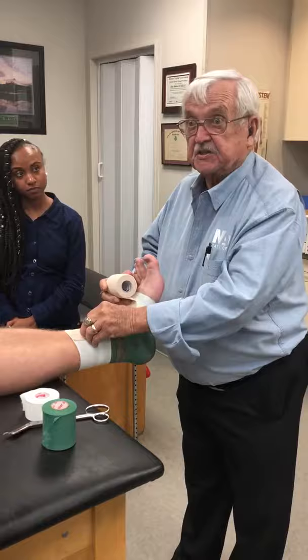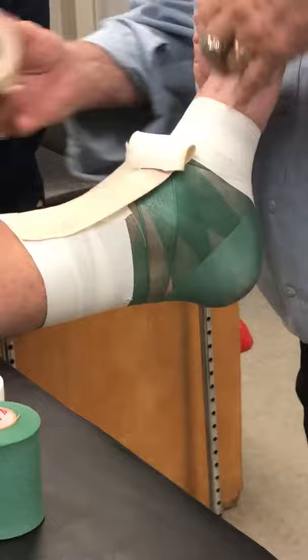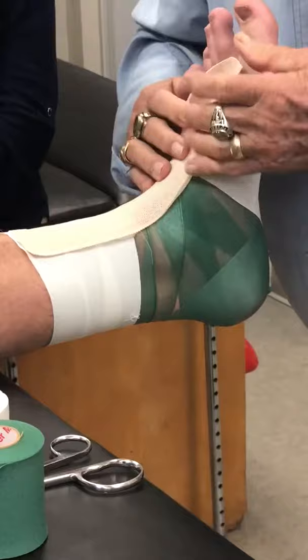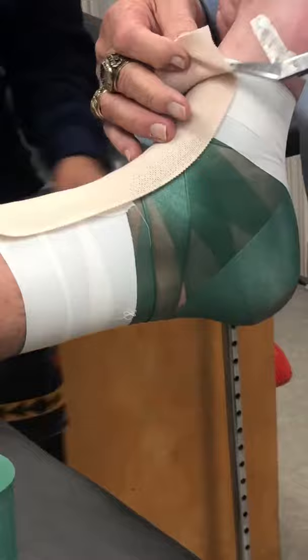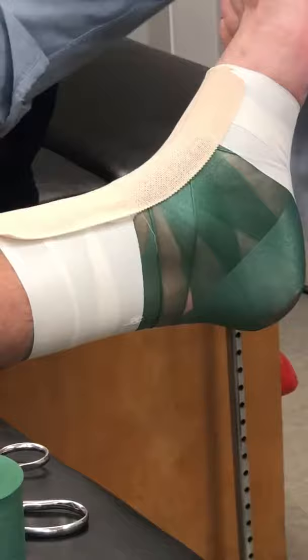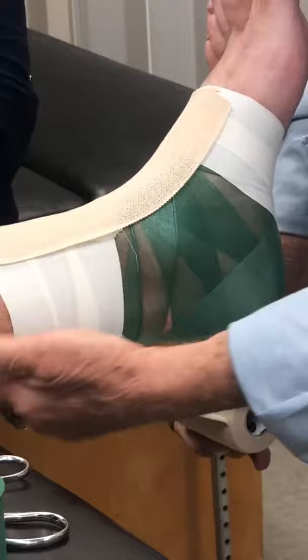With elastic tape, when you put that first one on, leave all the elasticity in it — don't take it out. Take all the elasticity out in here, leave it all in here, just like we did on this roll. That will stabilize the front of that ankle. Do the same thing in the back.